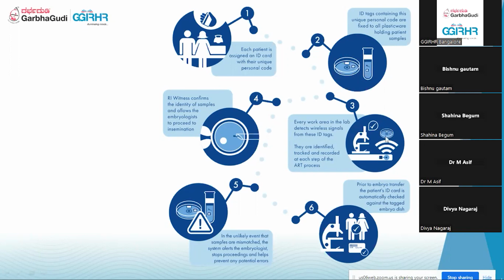In step 3, in the same coded tube we pour the patient's sample, where the sample is also witnessed, and we use the same coded dishes to handle the sample.